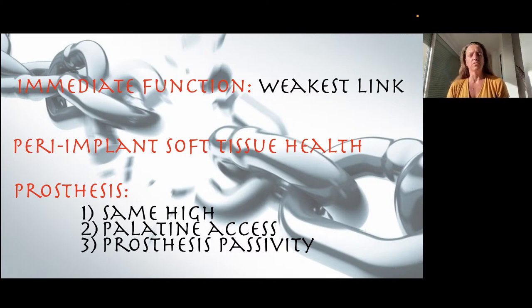And of course, in terms of the prosthesis, we know that these multi-units can also compensate any type of discrepancy that we have. Sometimes some of the implants might be deeper than the others, so we will have these multi-units compensating, having the bridge at the same height, which is very, very important.